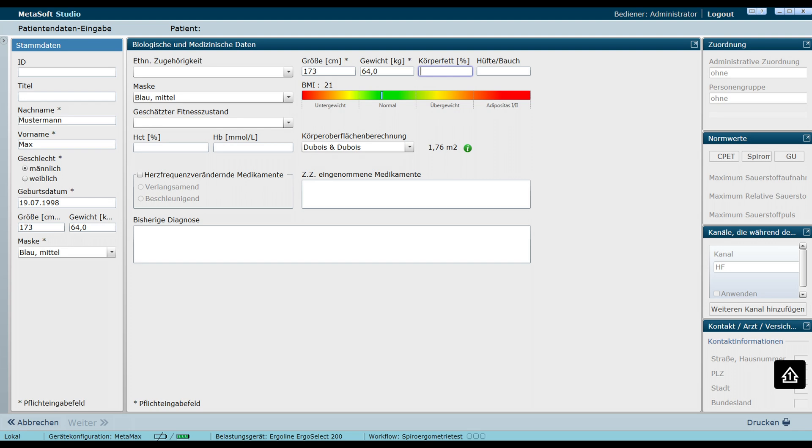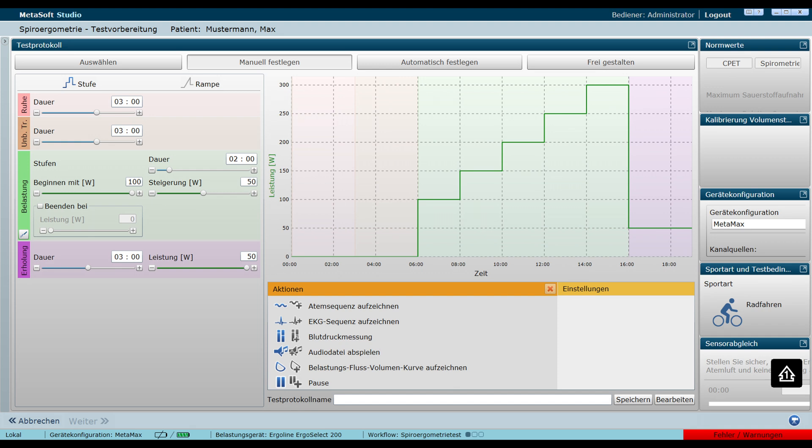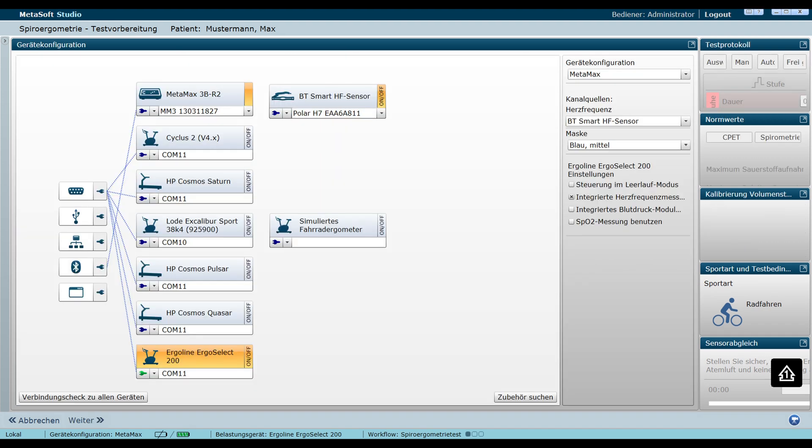After the calibration has been completed in the software, a test person should be created. The data marked with an asterisk must be filled in. After a patient has been created, the next step is to select the protocol. A distinction must be made between ramp and step protocols.